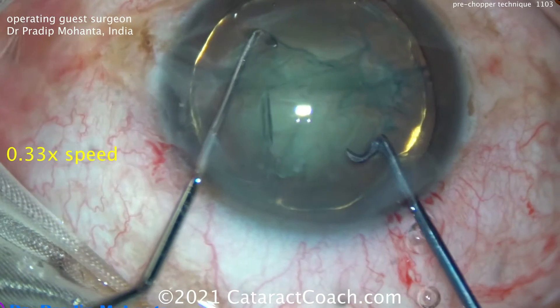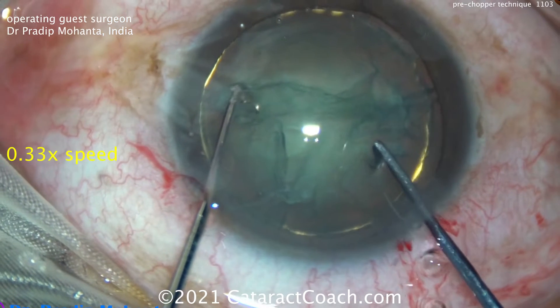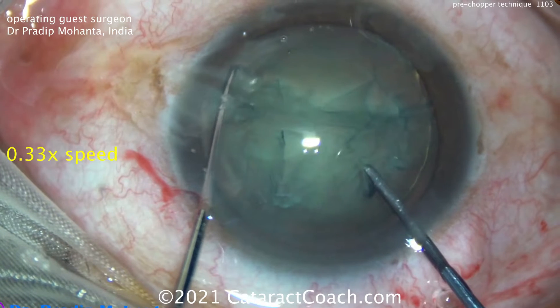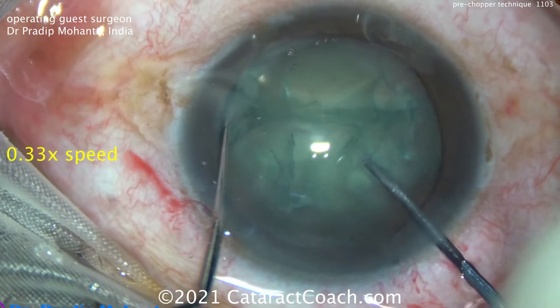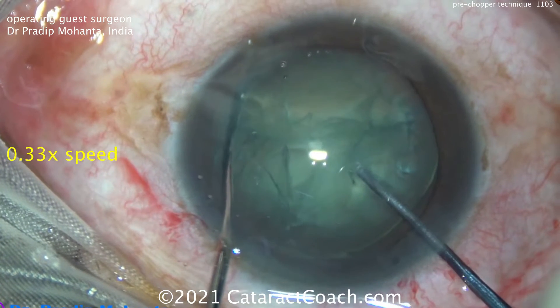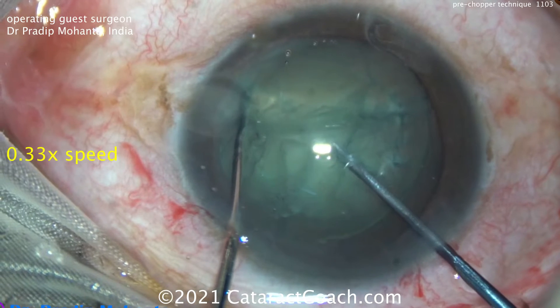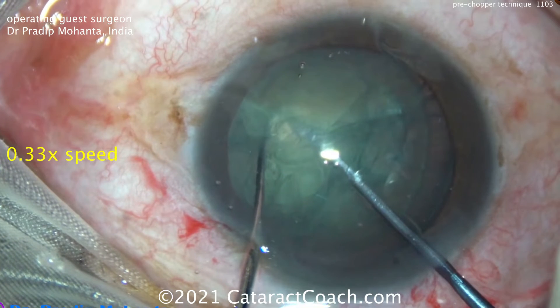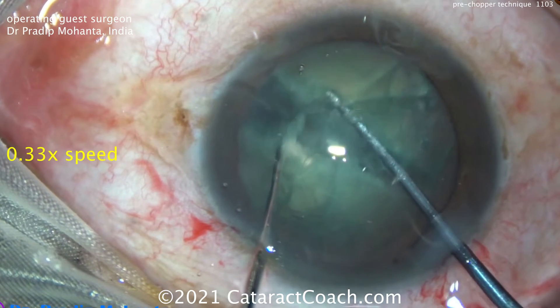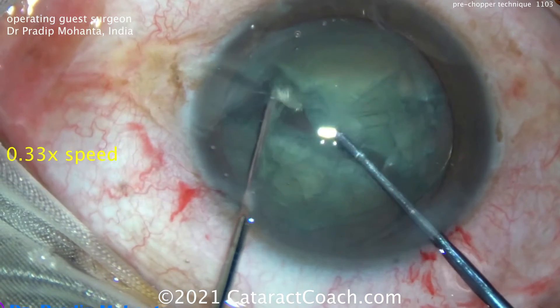Let's watch again in slow motion. Placement of the chopper is just inside the sub-incisional capsulorhexis, and it goes into the nucleus. It's holding one end of the inner nucleus. The chopper goes around just inside that nasal capsulorhexis. Then the two instruments are brought together — a little bit more, a little bit more — creating the propagation fault line. That's what's going to crack. And when you pull it apart, you propagate that crack all the way through and get complete separation of the two halves.